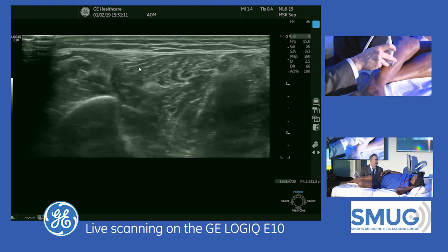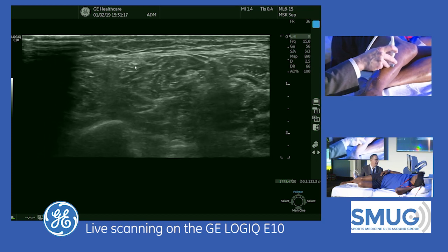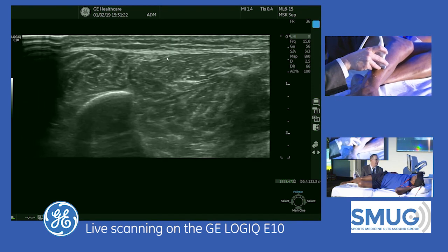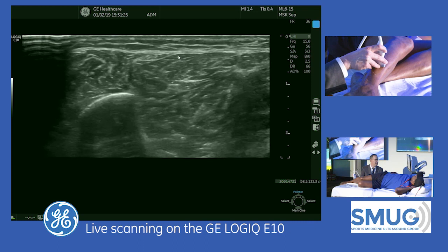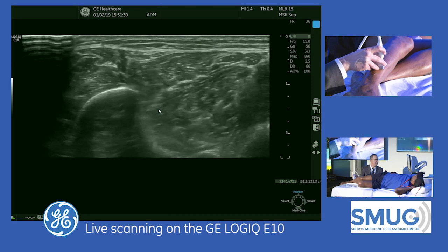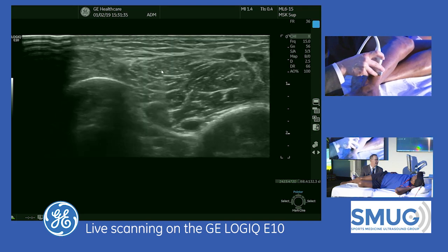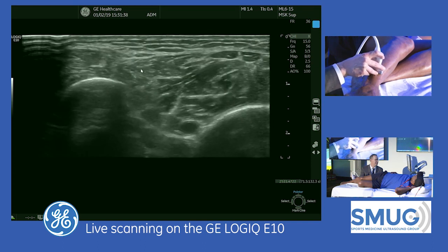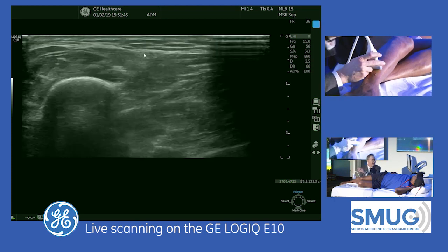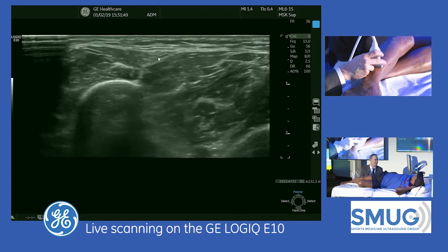If I go proximal, you'll see it here, and it gets difficult because it's diving in — it blends in with the muscle. But when I go more distally, you'll see it right here between the two compartments under this fascia. It's going to pop out of that fascia. So now it's out of the fascia. If I back up, it's under the fascia. You can see it's nine centimeters, just the way I anticipated. That's where you'd see entrapment.